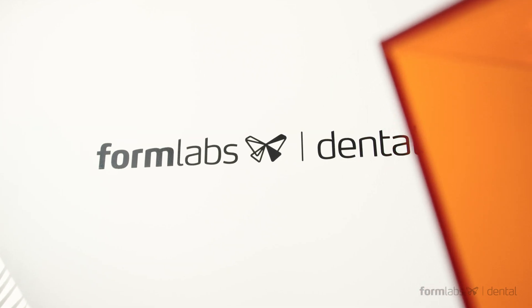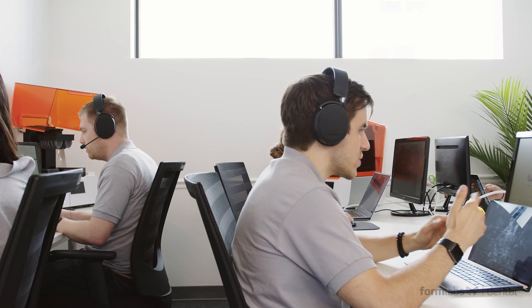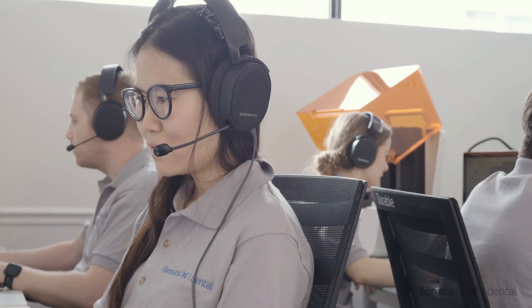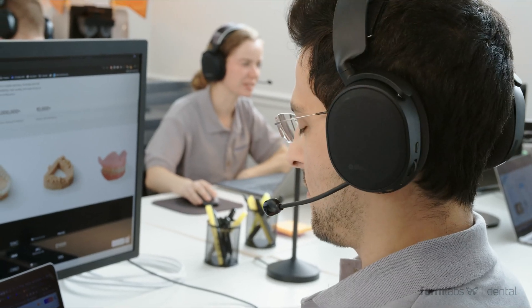From there, the part is ready for sterilization and use. And whether you're new to dental 3D printing or a CAD CAM guru, the FormLabs dental team is here to help. Our new dental service plan includes personalized onboarding training, proactive check-ins, and the best phone support in the industry.